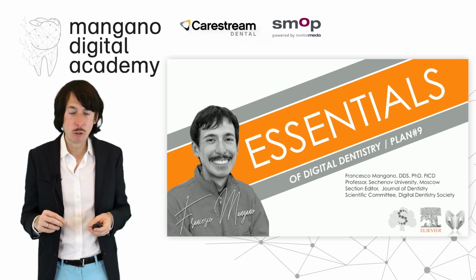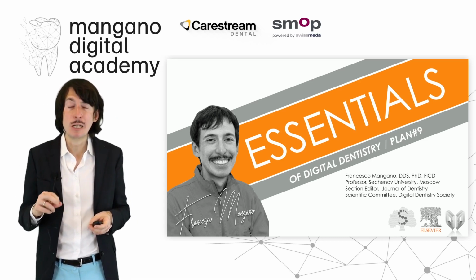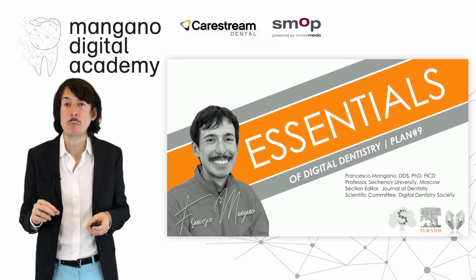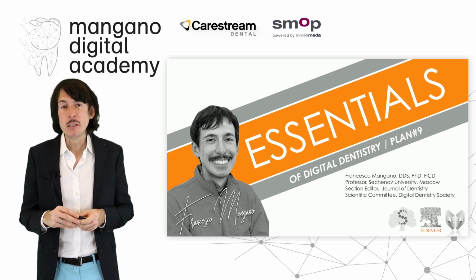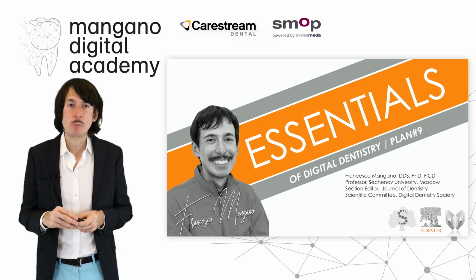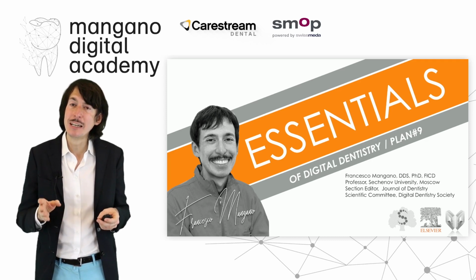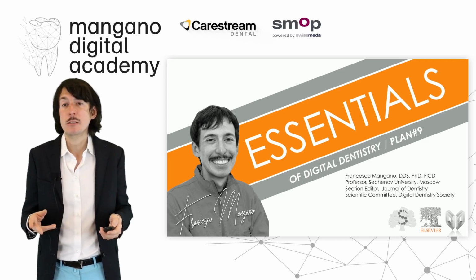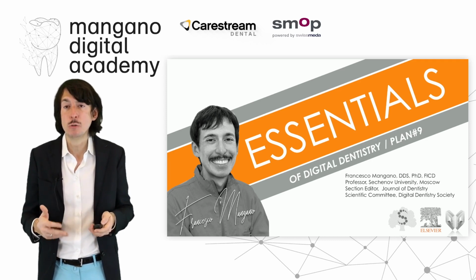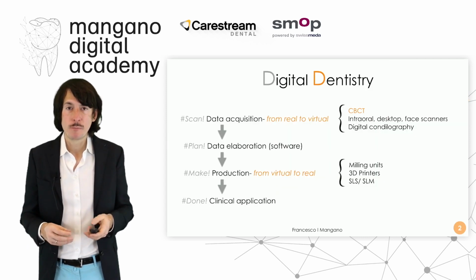It's an interesting topic for me because I've studied gnathology for many years and I'm really interested in that. I'm interested in temporomandibular disorders, but in general, digital dentistry now gives us more possibilities to treat patients in a smooth, very direct and straightforward way, and it's really nice to do it. And I will show you some cases in order to understand how we work, in order to share our knowledge and the way we work with you.